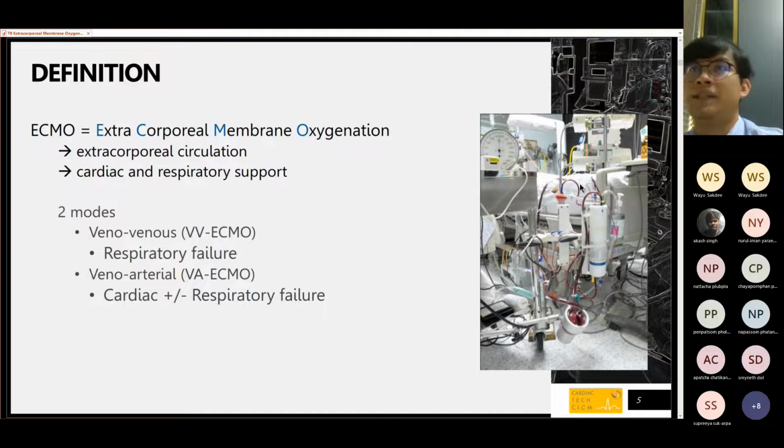Here is the ICU bed, and you can see this is quite a compact circulation beside the bed. You see this is the centrifugal pump, and the long cylinder here is called the ECMO oxygenator. It is quite different from the current design, but this just shows you how complicated this case is, right?